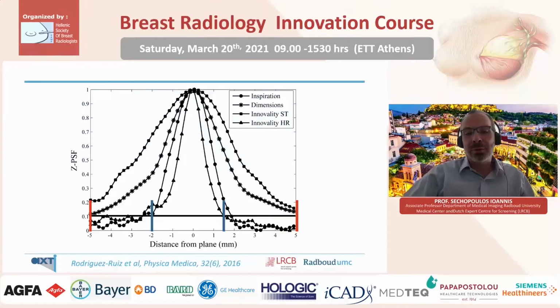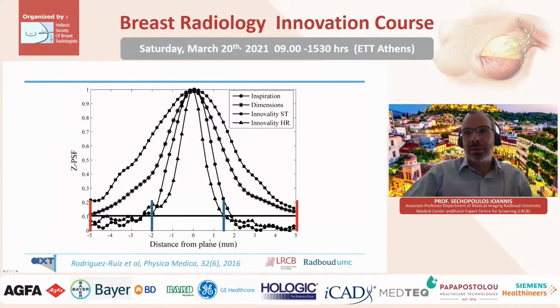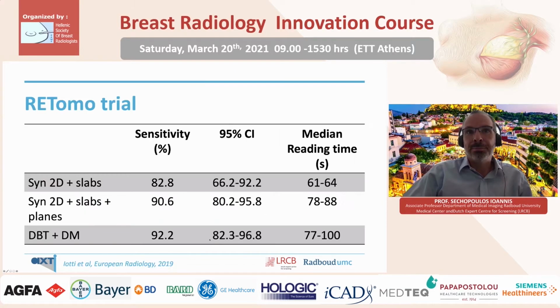Of course, what we don't know is if we use different tomosynthesis systems that have different angular range, and therefore a different vertical resolution, is this also just as valid? As we know, for a wide angle tomosynthesis system, the vertical resolution is considerably better than for other systems. The amount of information in the same slice increases the narrower the tomosynthesis angle.